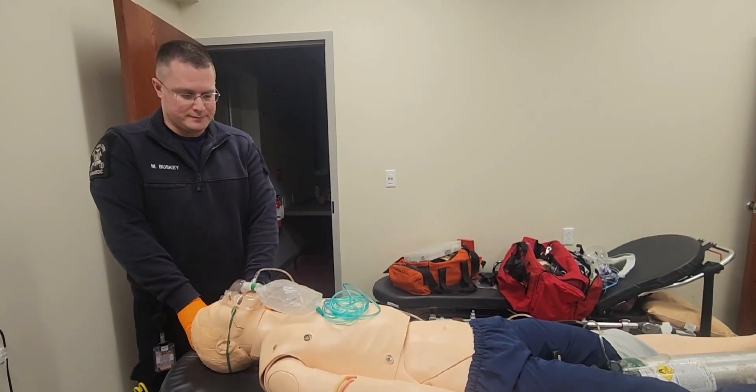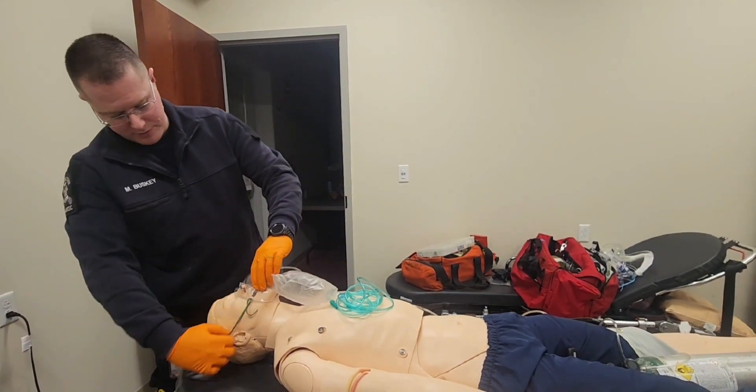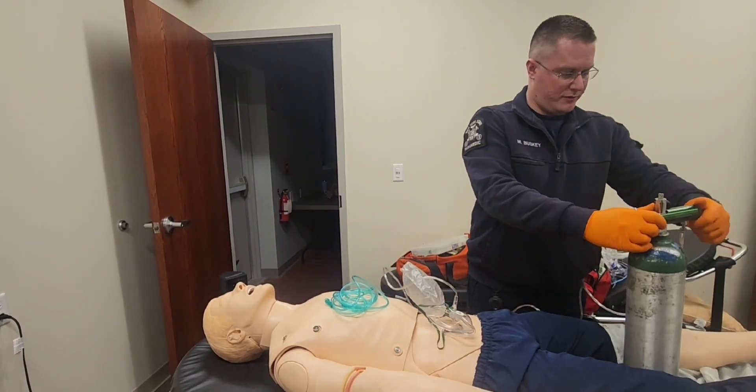Your patient is not tolerating the non-rebreather mask. Please remove the non-rebreather and apply a nasal cannula. I'll take off the non-rebreather mask and turn off the oxygen flow to it.